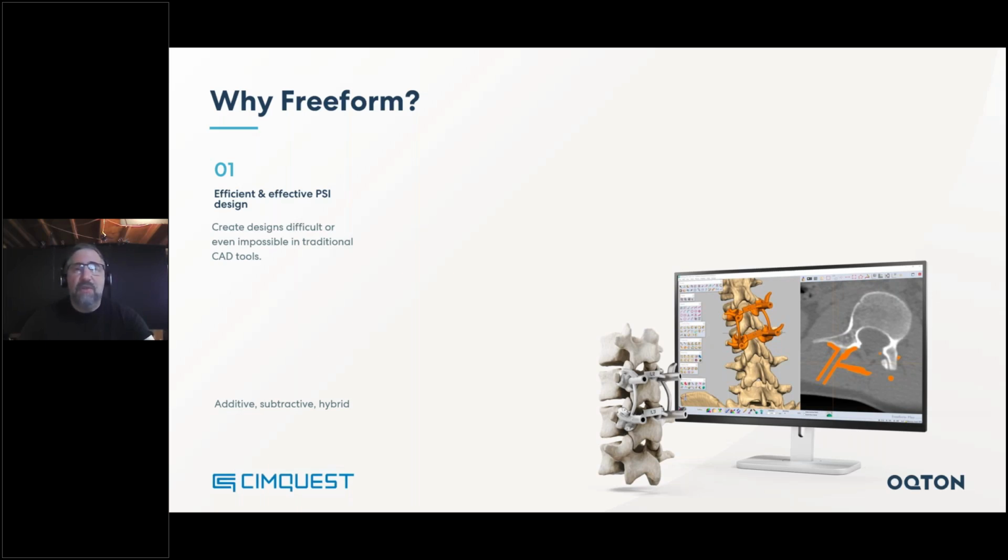We were able to complete the 3 cases in an afternoon, deliver them the parts, show them the parts, and they were happy with it. And later they reported back to us that the first case would have taken them a day to do in their system. The second case traditionally took about a week to do in their system, and the third case was impossible. So Freeform not only removed barriers, but it showed an incredible amount of efficiency.